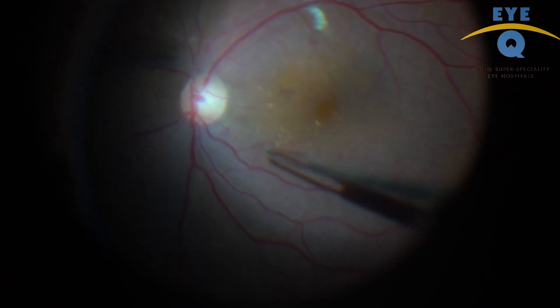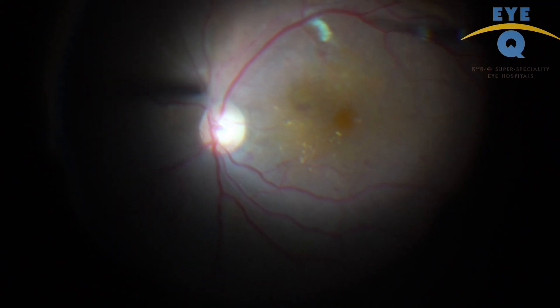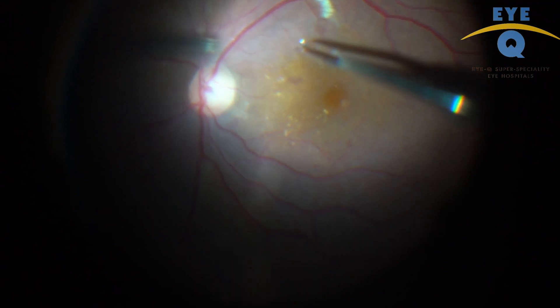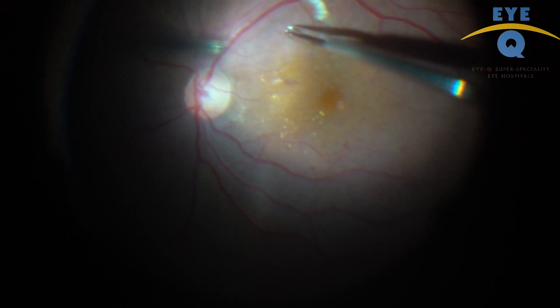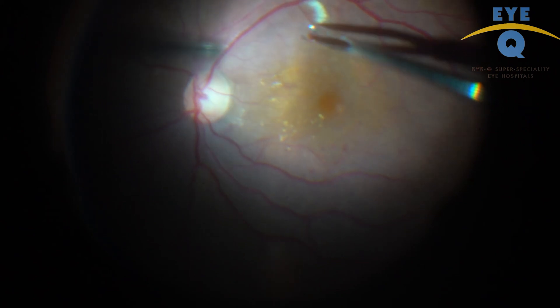This video intends to share the technique to remove ILM in bigger sheets by long peeling. Watch this video where ILM is removed from the macula in just 3 or 4 grasps.